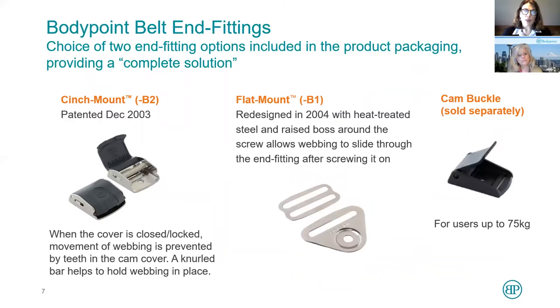To attach a belt, you first have to start with an in-fitting that's going to attach onto the chair. In 2003, BodyPoint patented the cinch mount — this metal buckle that you weave the webbing through and it will keep the belt in place. We also have a flat mount. The cinch mount, I just want to contrast to a cam buckle — it's not a cam buckle — and I'll show you some of the features of why and how it works differently.